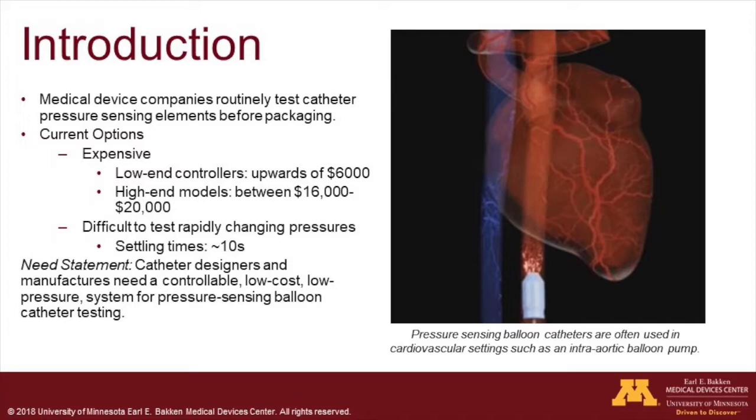Medical device companies that aim to sell catheters with pressure sensing elements need a way to test their systems before packaging their product. An example of one of these products is an intra-aortic balloon pump, which provides mechanical pumping assistance to a patient experiencing cardiogenic shock.